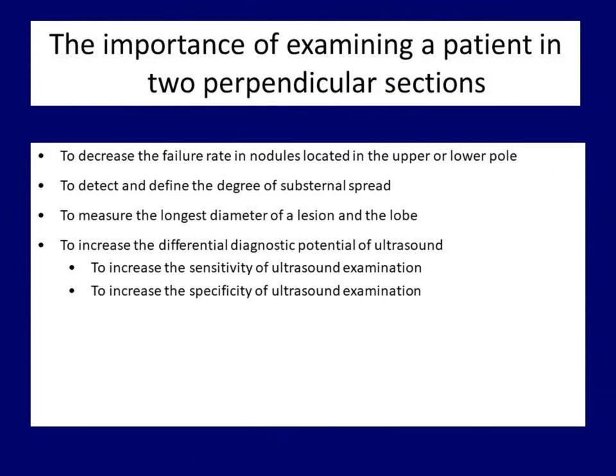We have to perform an ultrasound examination compulsorily in two perpendicular sections. In horizontal scanning, we start with the investigation above the thyroid and move downward with the transducer. In an enlarged thyroid, we have to repeat this procedure several times in order to visualize the whole thyroid. Thereafter, we rotate the probe squarely and move from lateral to medial.